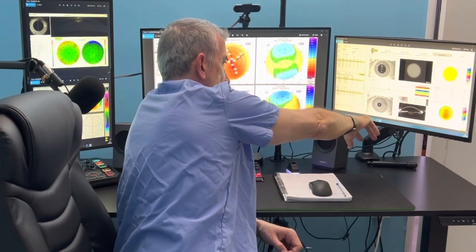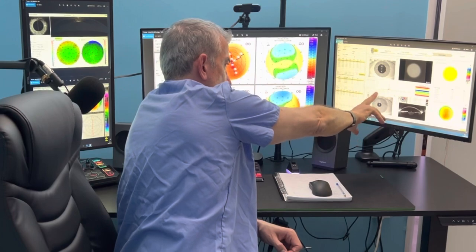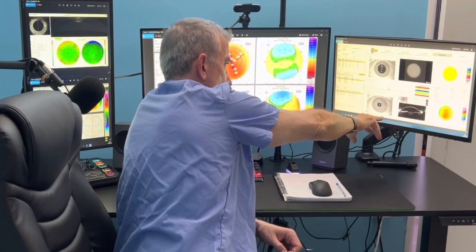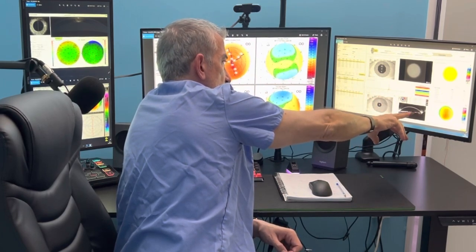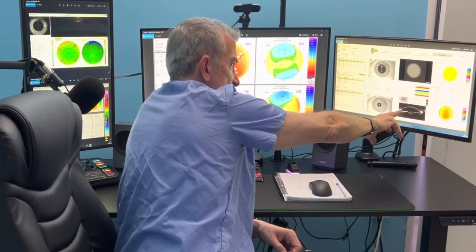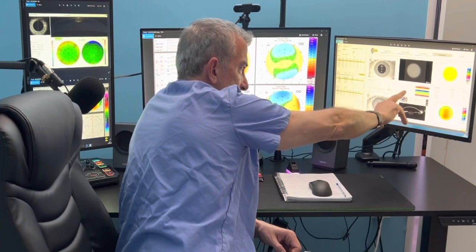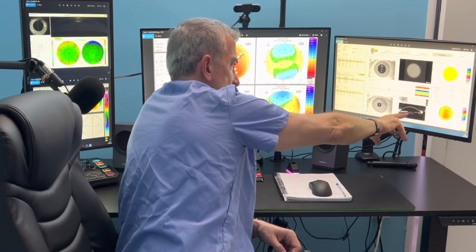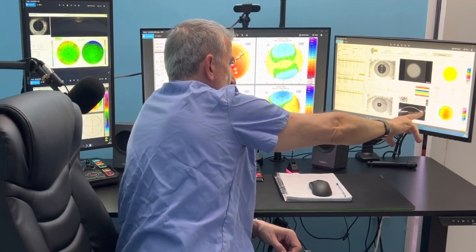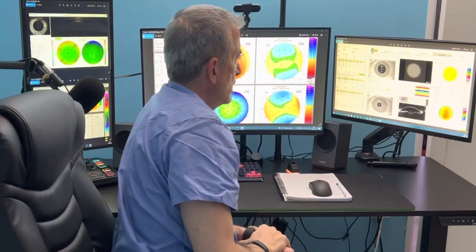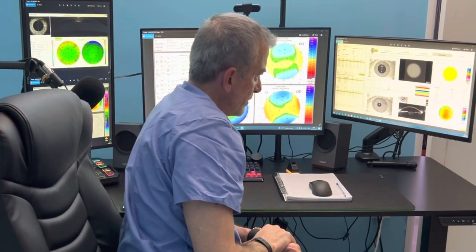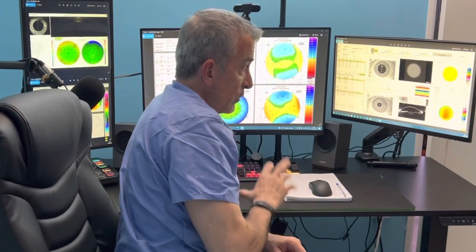We're seeing that these are good Pentacam maps because we have good exposure of the whole cornea. This is the vertical Scheimpflug image documenting that there are no eyelids in the image. So these are acceptable and well-documented images with this device as well.